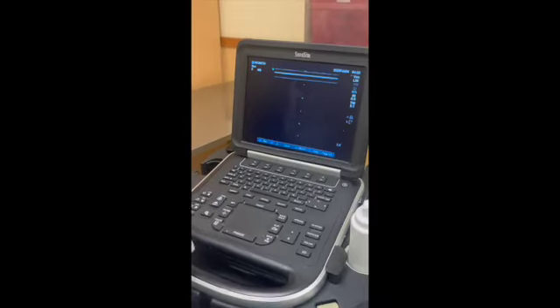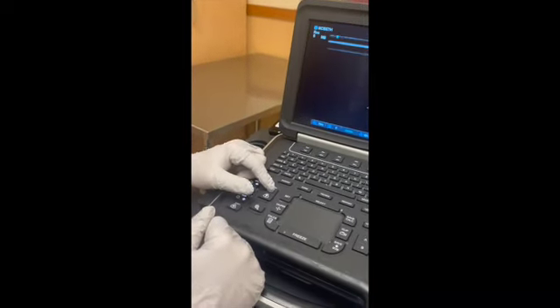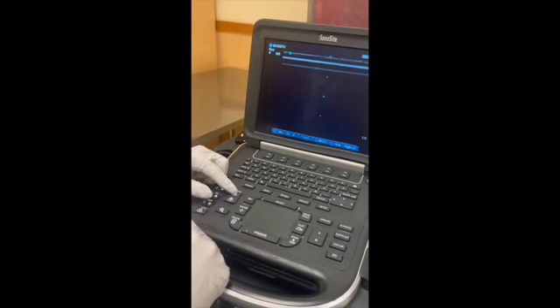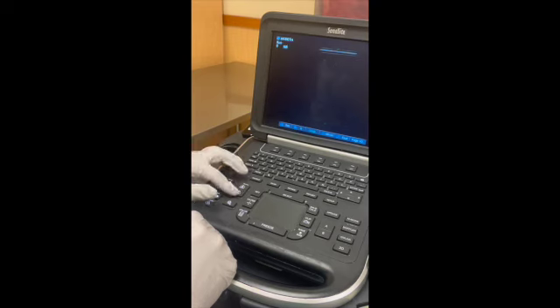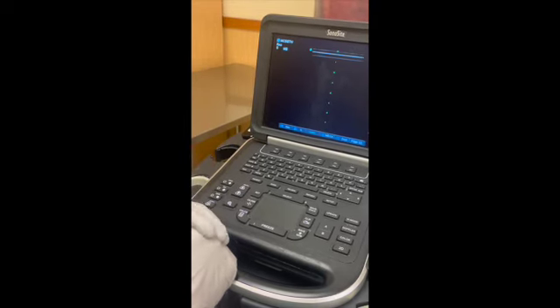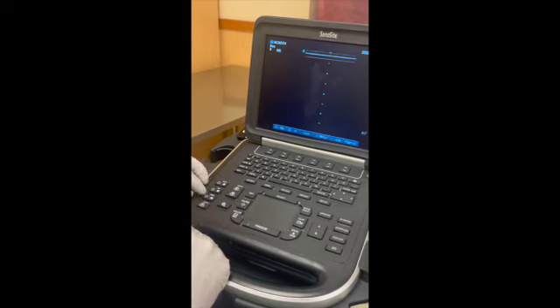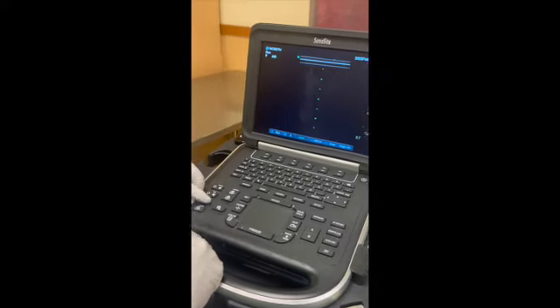Depth — you can't really see it right now because we're not on the arm, but the depth buttons are up and down. When I do mine, I like to have my depth all the way out to start and then zoom in on the vein I want. Gain controls your brightness — lighter or darker.